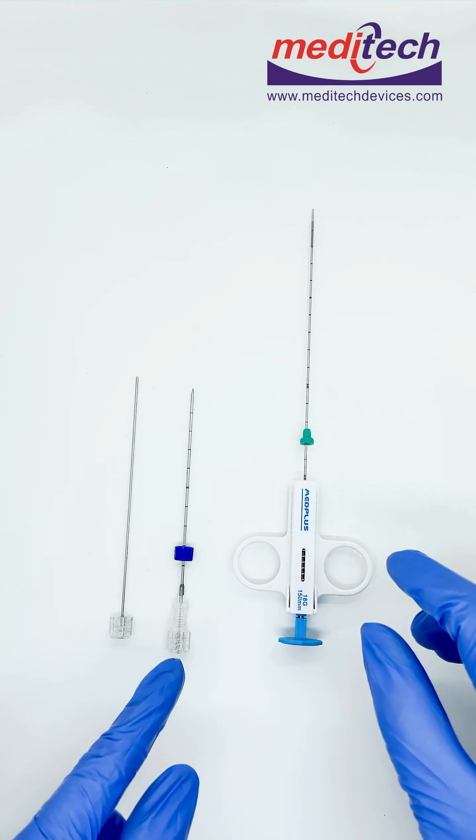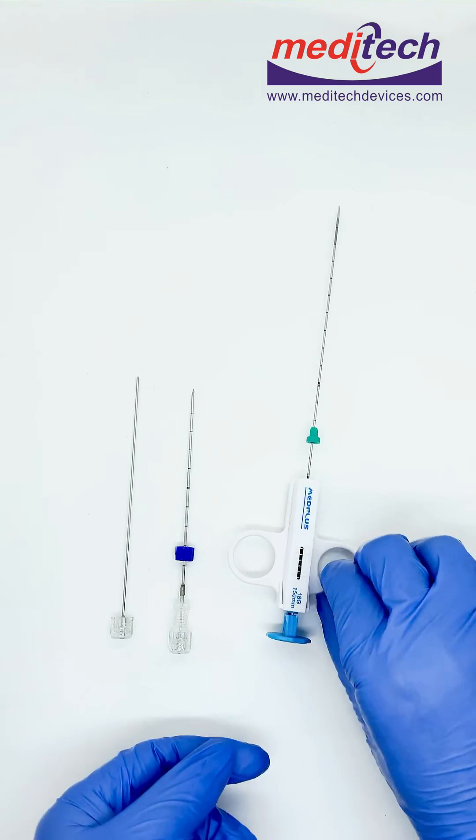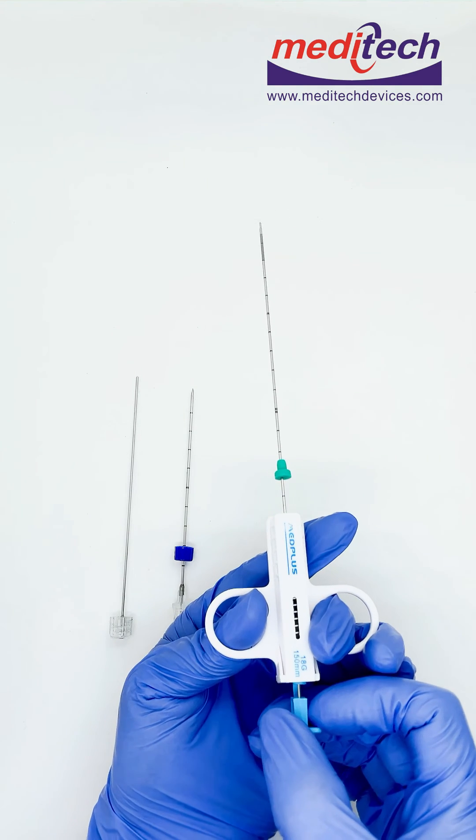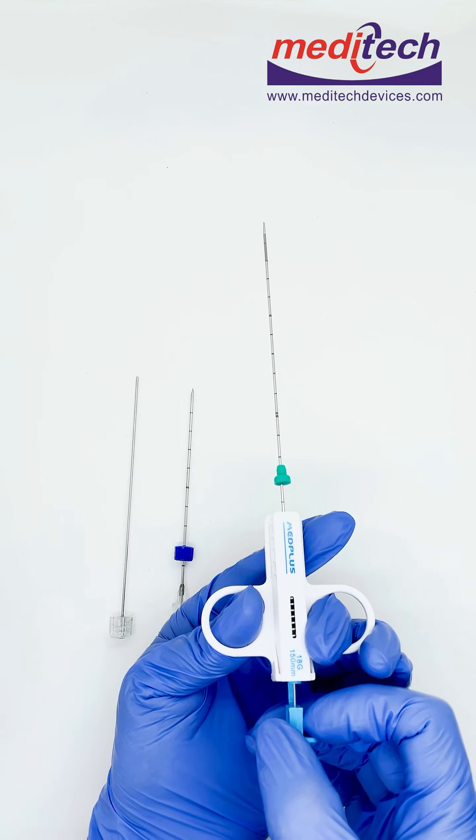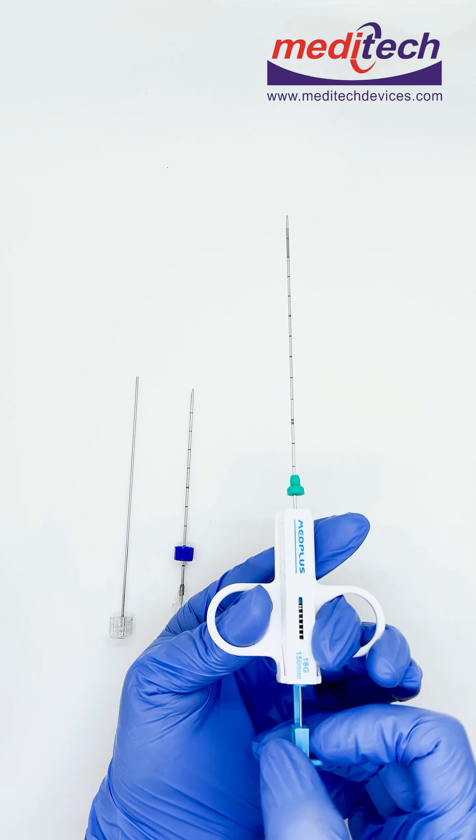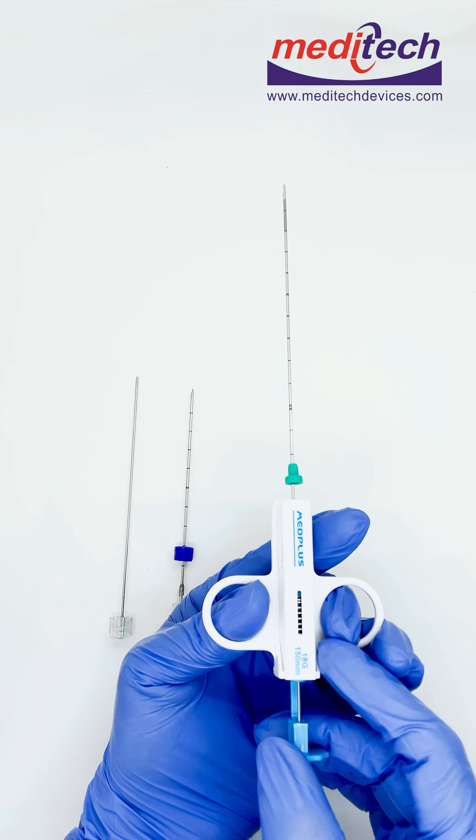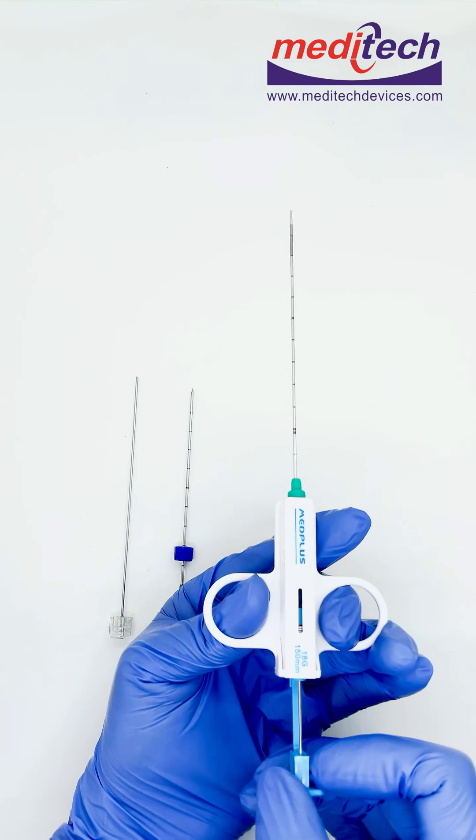Now I will demonstrate how the needle is used. You have to hold the needle like this for loading the instrument. Once you click, the instrument is loaded to one centimeter penetration depth.